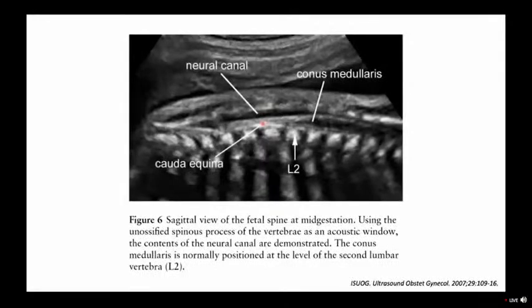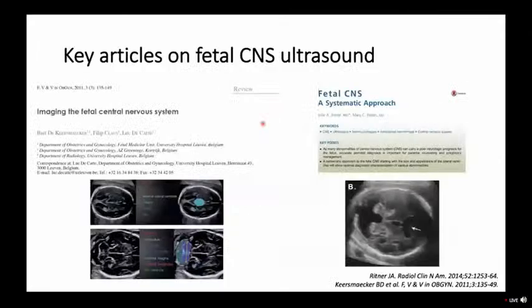So just a clue, we pull out maybe our EL18-4 linear transducer when we're trying to look at the spine. It can provide you some really nice images of the spine. You have to move slowly because of the frame rate, but it can reward you with some real high quality, accurate pictures.